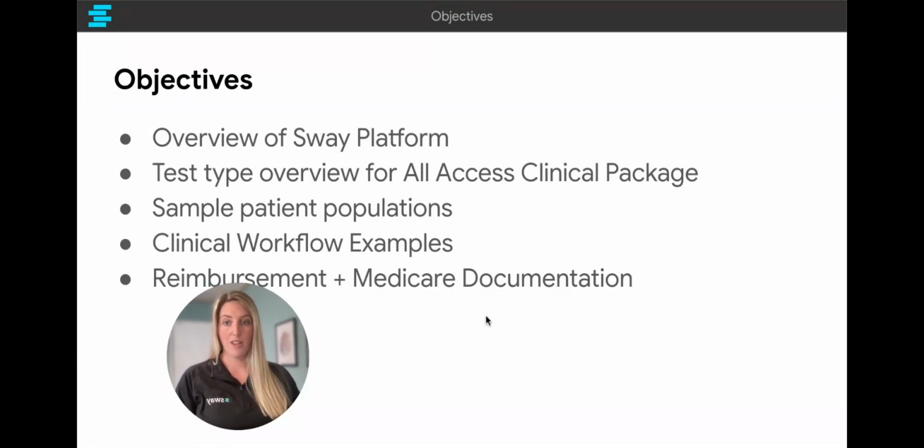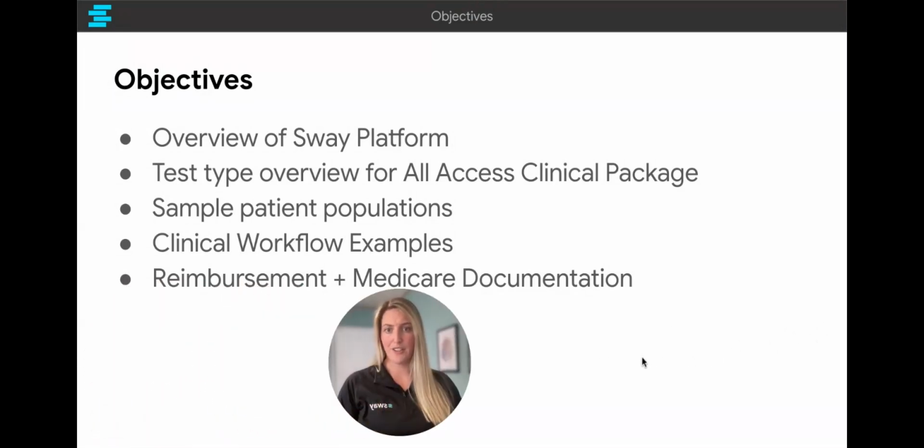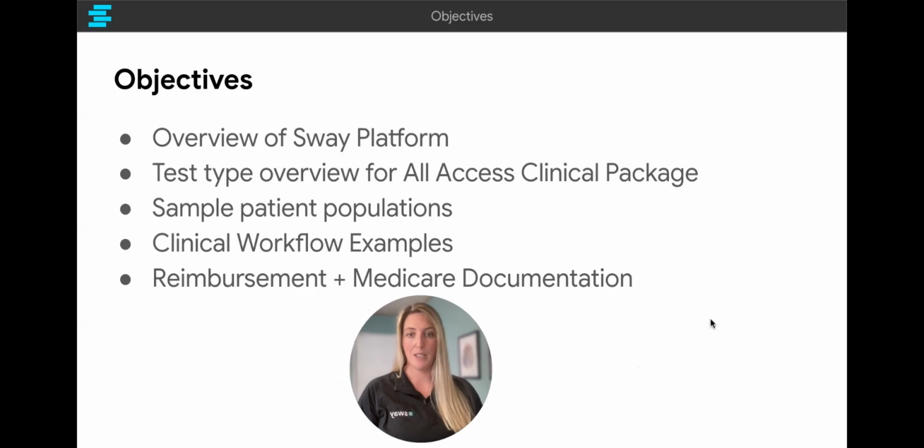A few objectives for today. There's going to be different sections, so feel free to skip ahead if that's something you need to do. We'll do a quick overview of the Sway platform and dive into all of the testing modules that are available. Go through some patient populations, most importantly, talk about how it's going to fit into your workflow, and go through some reimbursement and Medicare billing codes.